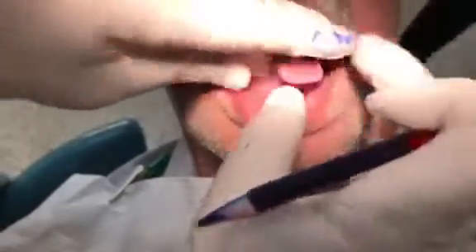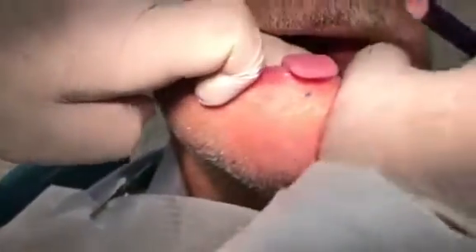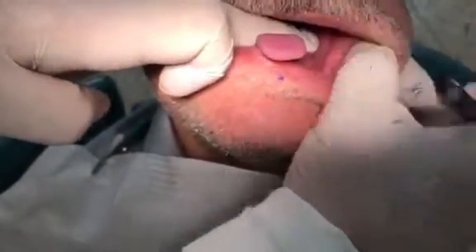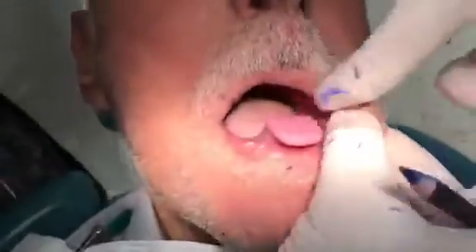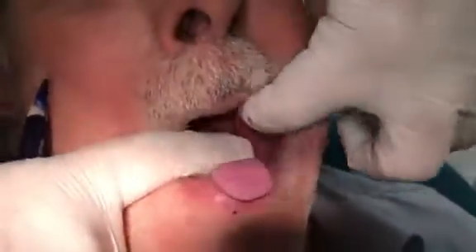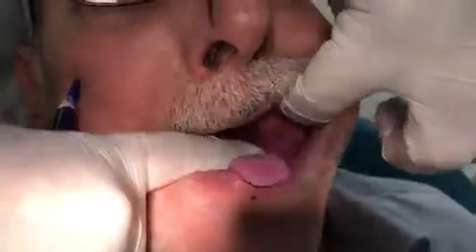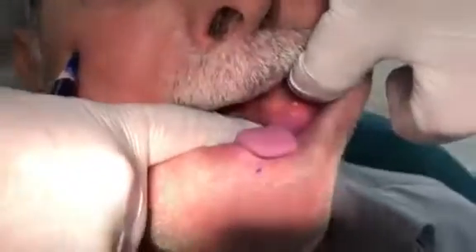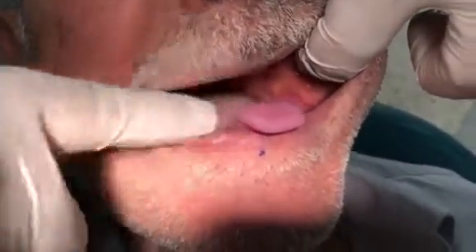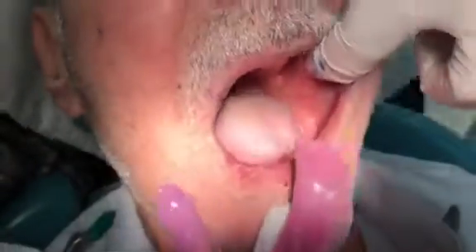I'm going to put this inside the patient's mouth and look at this corner. Is the tray encroaching buccally on the masseteric area? See how the tray is going laterally to the side too much. If you are confused and not sure, remove the tray and look at the sulcus without the tray.